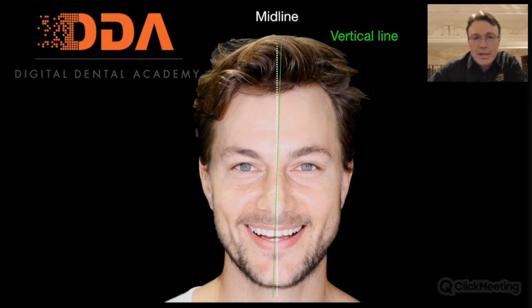So for me, the main and the most important thing when we start doing smile designs and designs of the actual incisors is to get that vertical line correct. So the more difficult thing is to translate that vertical line from your patient into your actual CAD software.